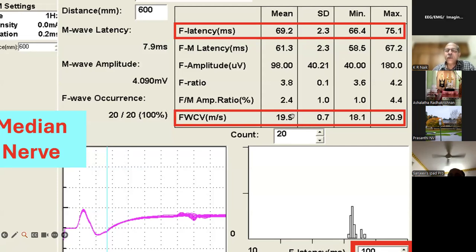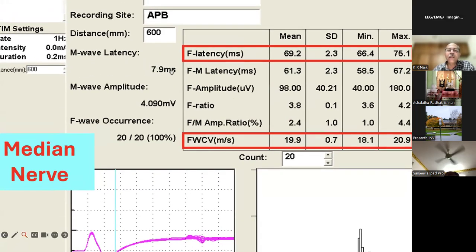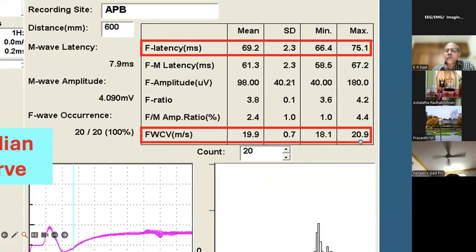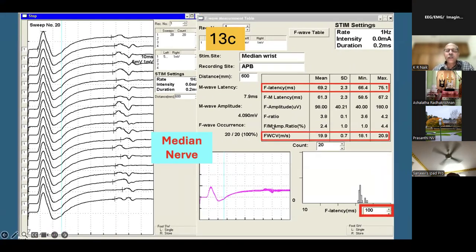So that is not only demyelination peripherally, as evidenced by increased distal latency, but you have slowed conduction throughout the median nerve axon going till the anterior horn cell. And because of this increased persistence, in addition to demyelination, you probably have a UMN lesion, a possibility.